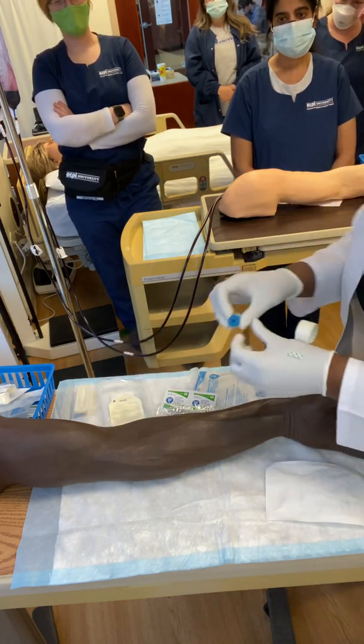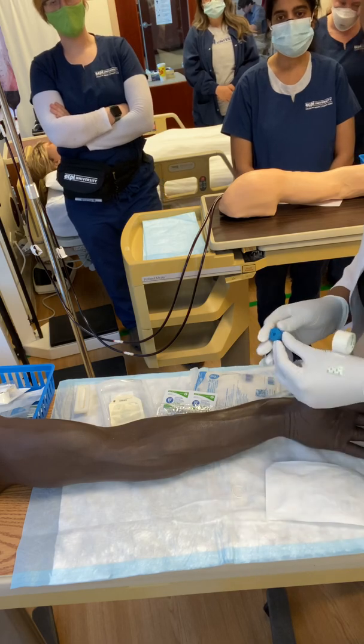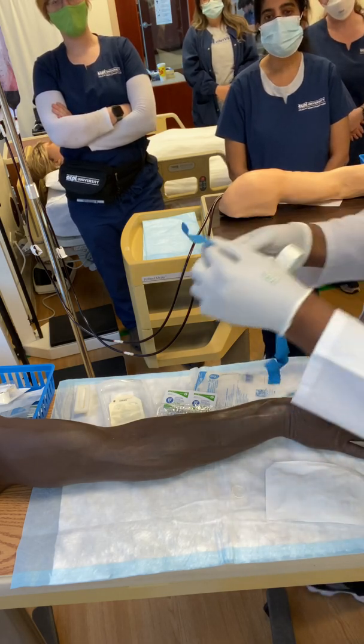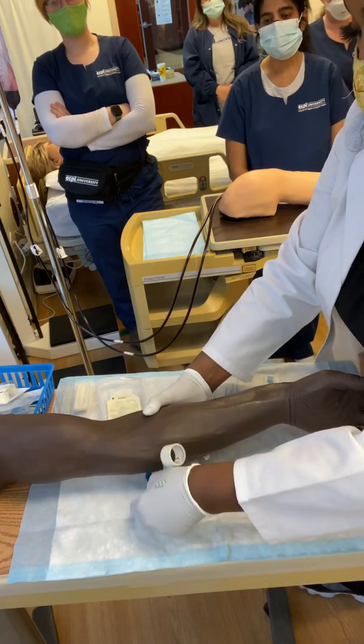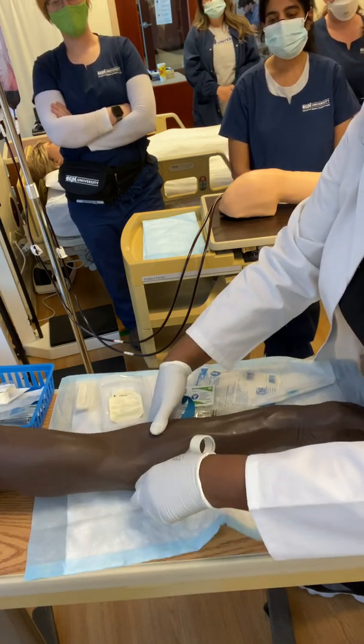All right. So now we have our tourniquet. We have our site. So what we're going to do is put our tourniquet right on the arm.